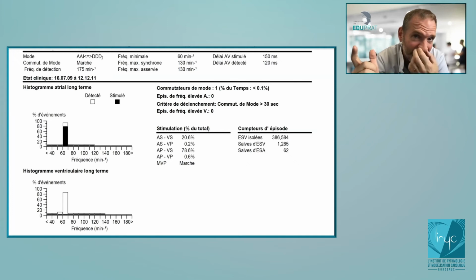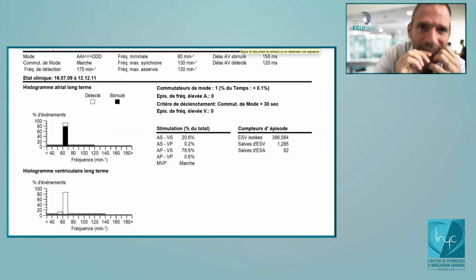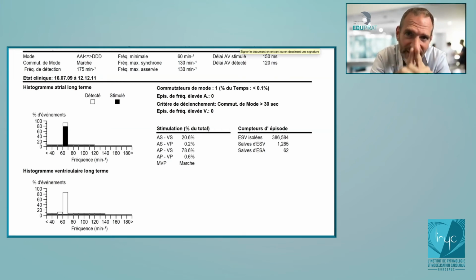It's clear? The thing is that you need to be cautious in this patient because in some patients with a very long time sinus node dysfunction, who were slow for years and years, be careful when you program the rate adaptive function. In some patients, they can be symptomatic. If you accelerate this patient up to 120, 130, some patients will say, okay, I'm not feeling so well.